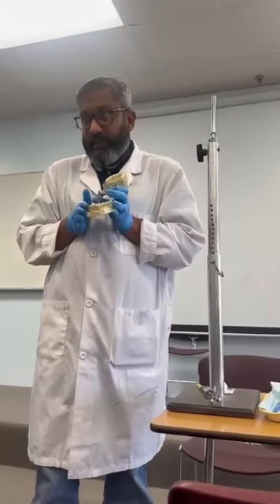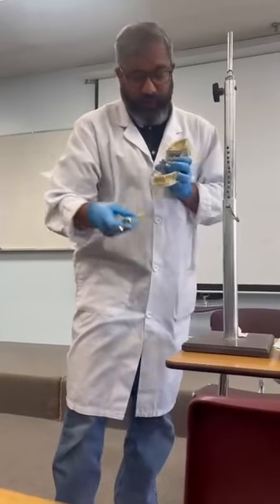For this side, which side is this? This is the right side, right? Right side of the patient. So if I want to give the injection on the right side here, I am coming from the left side. So this is the way the dentist will come here. So that is the injection they will give.